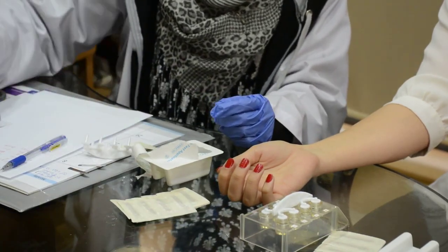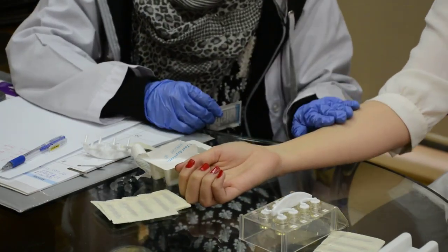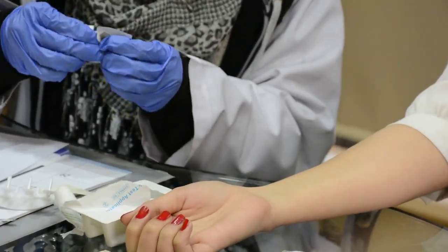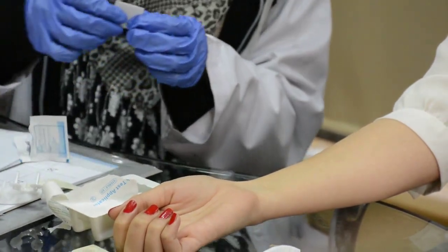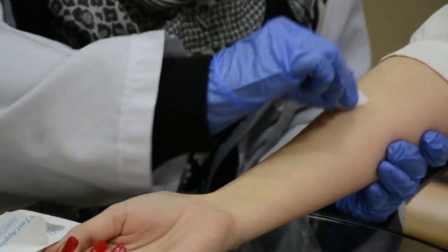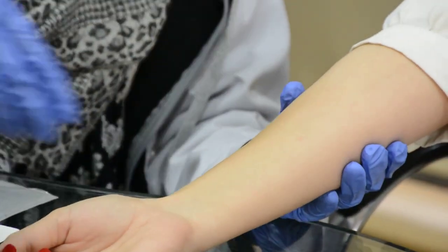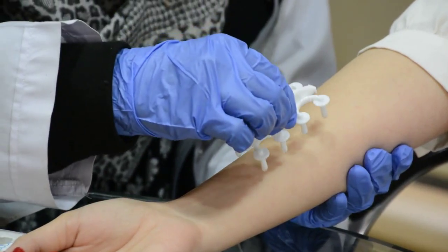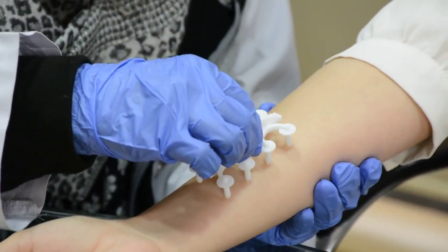The skin prick test is done on the forearm. A number grid is drawn on your arm using a marker pen. The multi prick applicator containing 8 different allergens is used to prick the outer layer of skin using light pressure. This facilitates the allergic response.